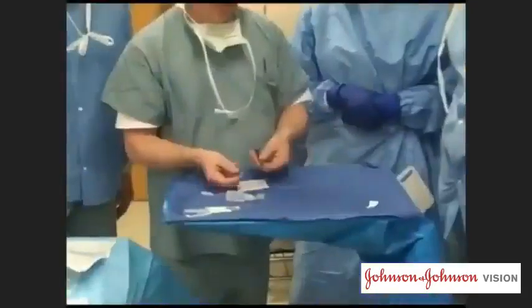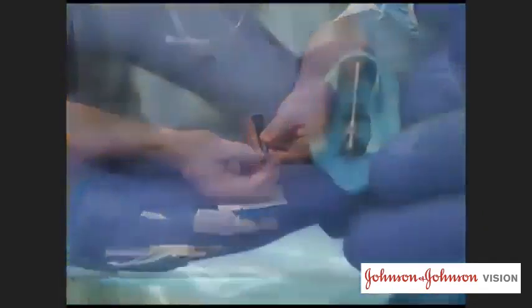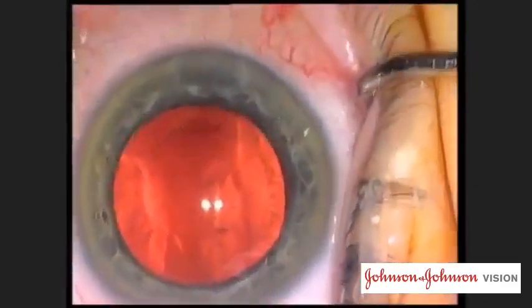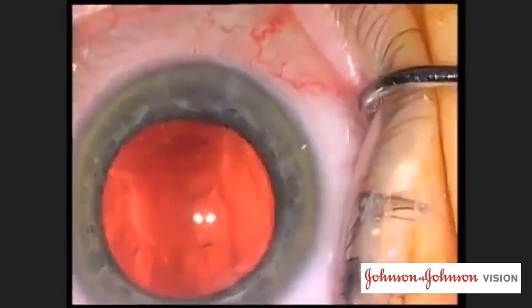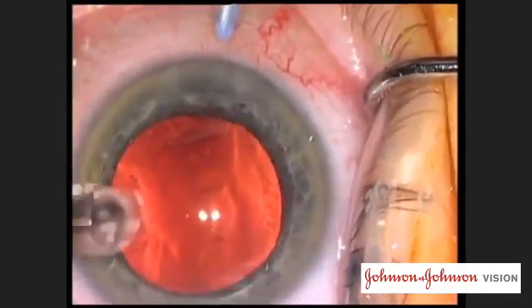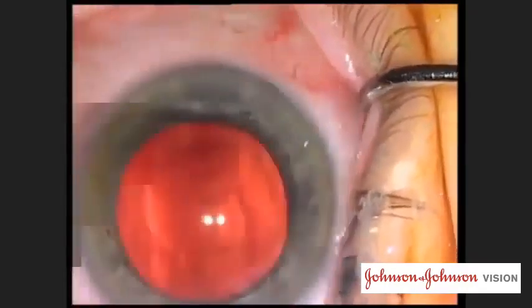The staff of the surgical center was retrained to properly care for the tips. Then new silicone INA tips were returned to the operating room. I was hypervigilant when I resumed use of these tips. The first tip I employed had been used 5 times. Under the operating microscope, I noted no abnormality.